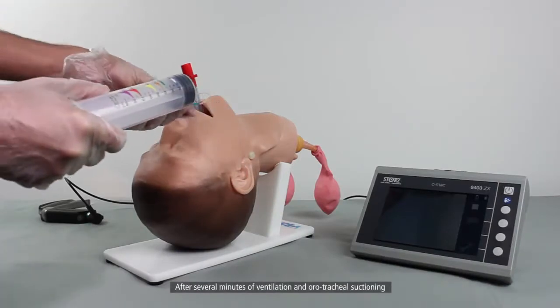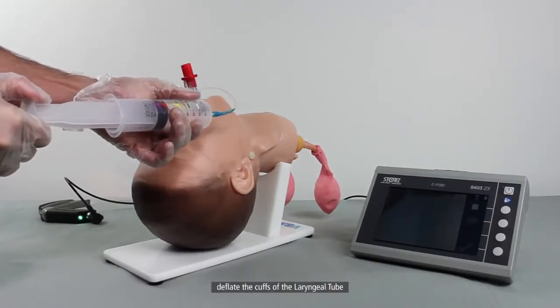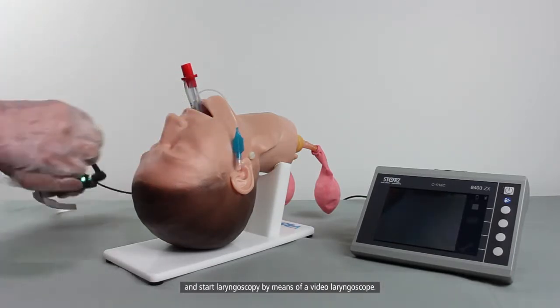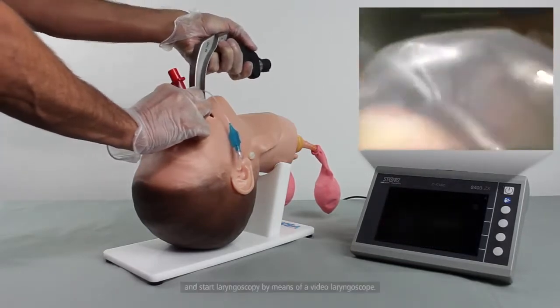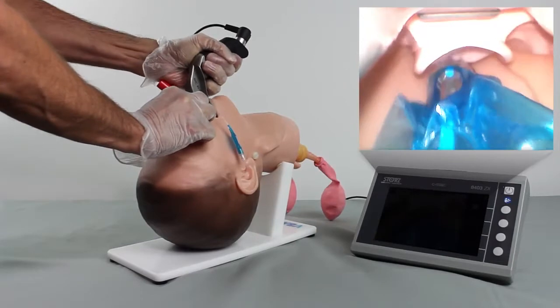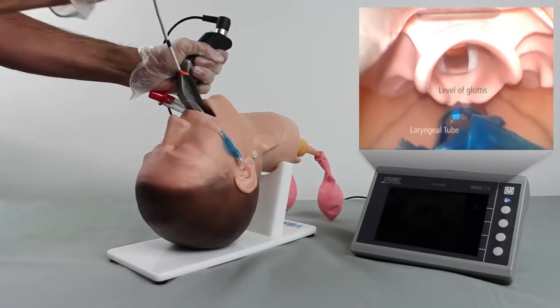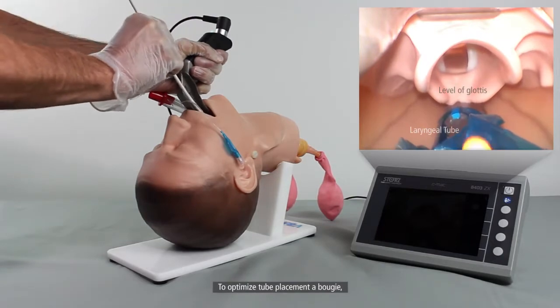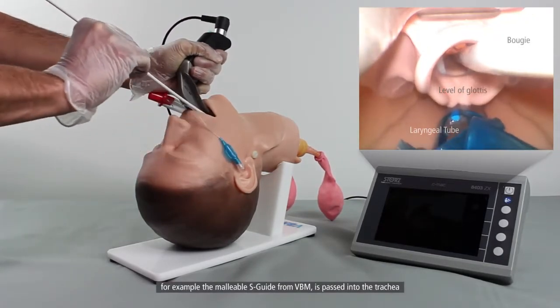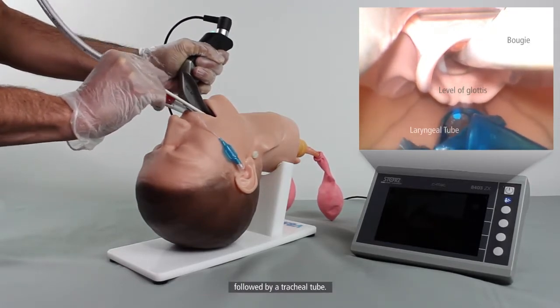After several minutes of ventilation and orotracheal suctioning, deflate the cuffs of the laryngeal tube and start laryngoscopy by means of a video laryngoscope. The glottic structures are visualized. To optimize tube placement, a bougie — for example, the malleable S-guide from VBM — is passed into the trachea followed by a tracheal tube.